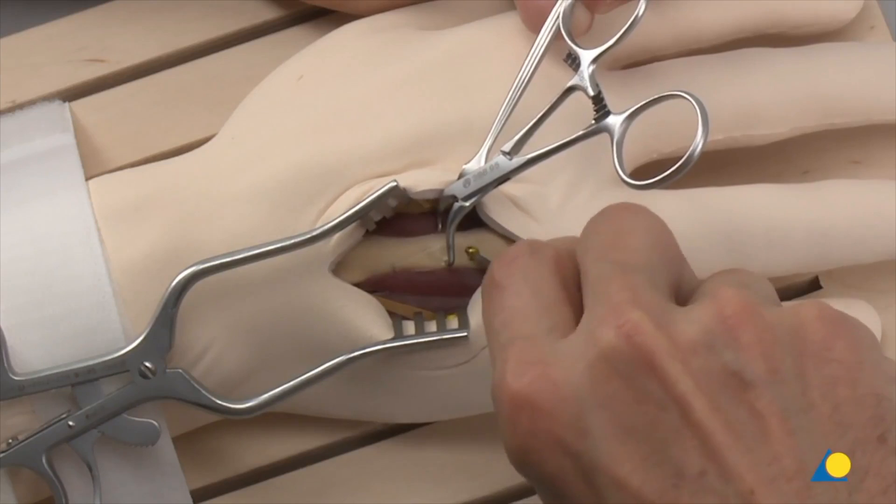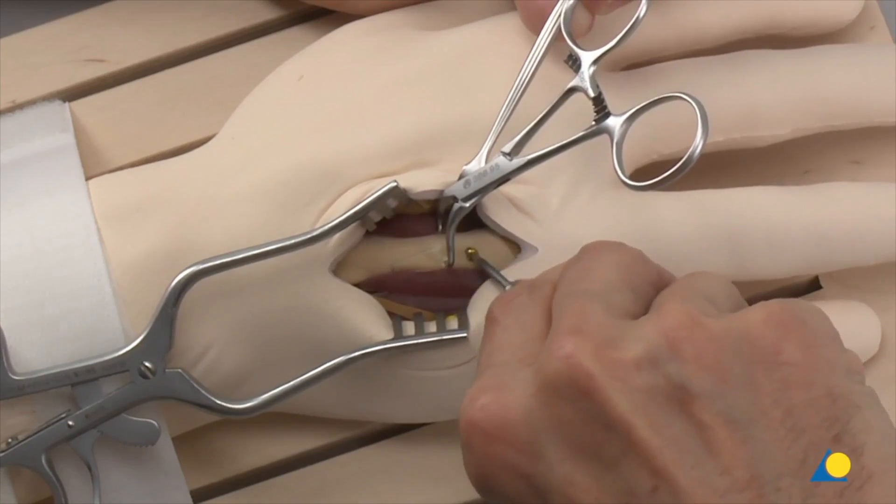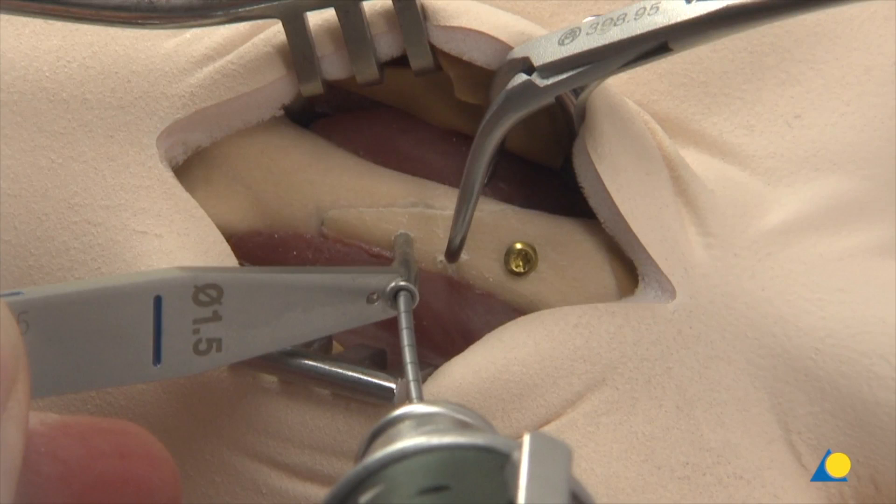At this stage the screw is not fully tightened. A second lag screw is inserted. A different technique is shown here — the so-called small bone technique. A minimum distance, which corresponds to the size of the screw head, between the screw hole and a fracture line is respected to ensure that the screw hole is not too close to the fracture lines.